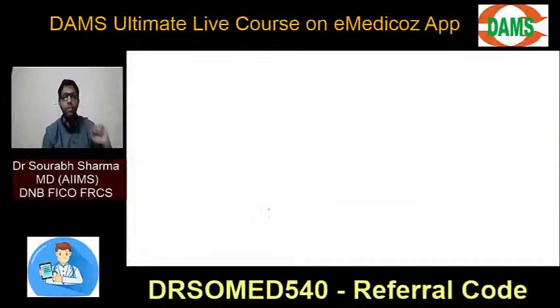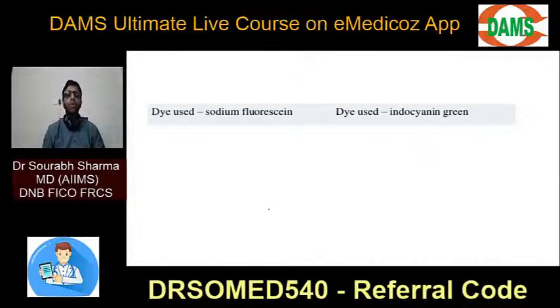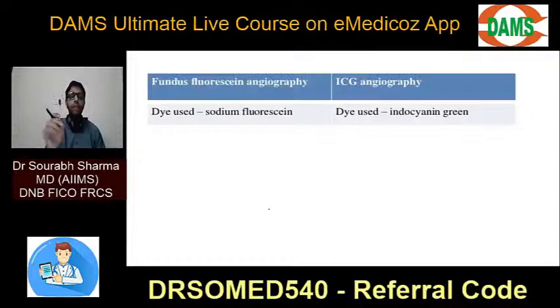So two dyes are used. Which two dyes? Fluorescein and indocyanine green. That's what the name is: fluorescein angiography, indocyanine green angiography. So two dyes are used for angiography, fluorescein dye and indocyanine dye. So that is the first question, which dyes are used?